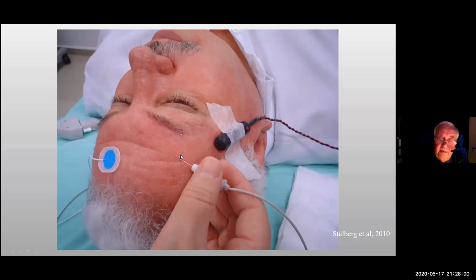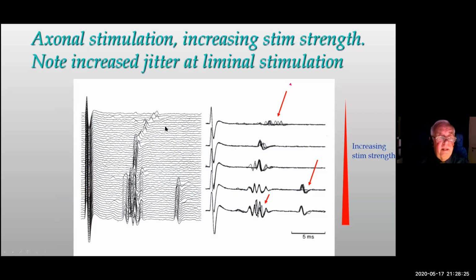We can also stimulate with a surface recording. And here we have placed it over the facial branch to the frontalis muscle, stimulate 10 hertz, maybe 8 milliamp or so, and we get a slight twitch, and we insert the needle in the twitching part. Here is a major problem with the stimulation, and that's why I do not use that as my first method. I use voluntary, but sometimes we use electrical stimulation, namely the following.